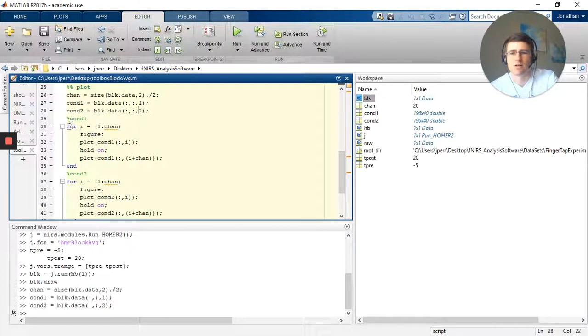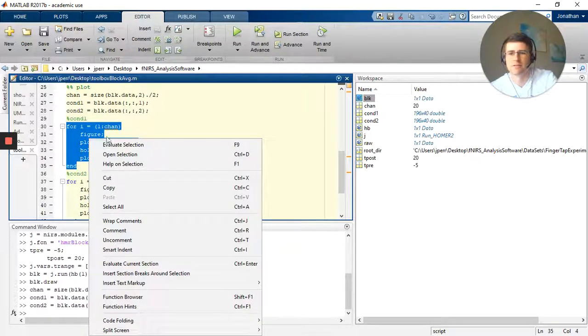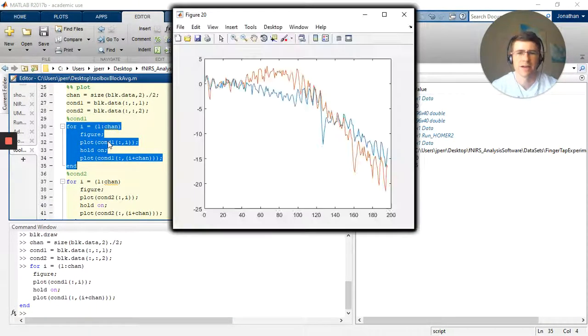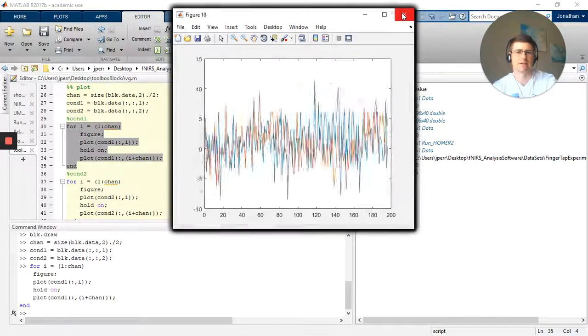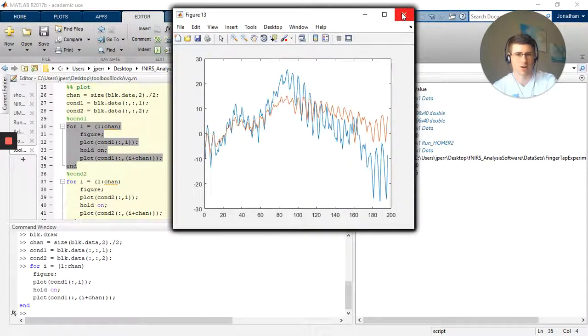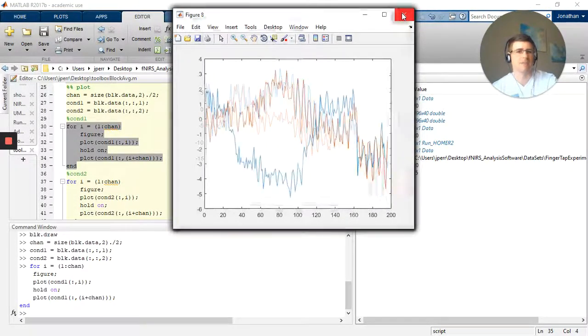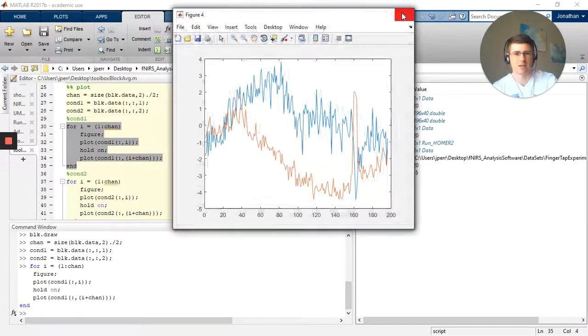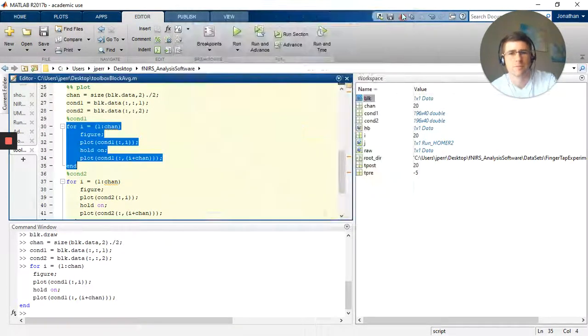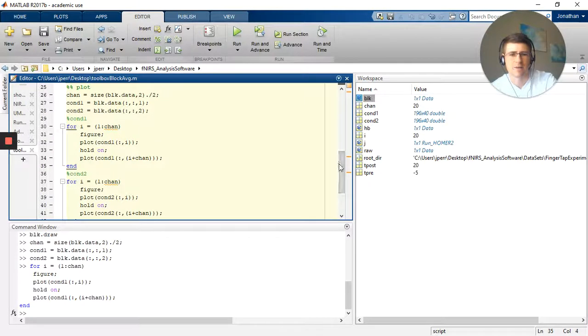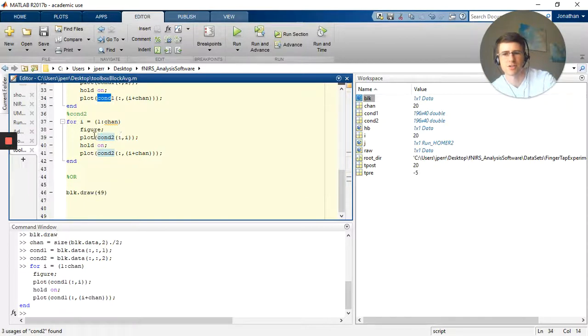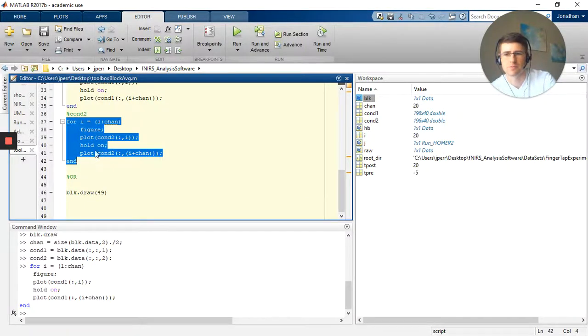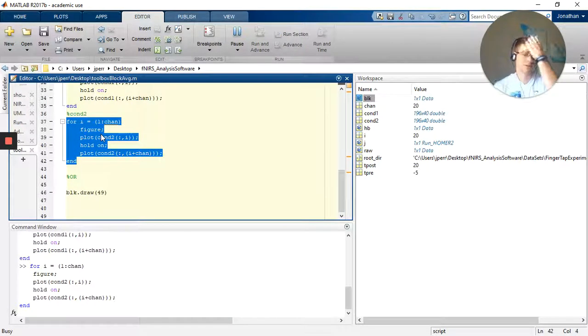So now I want to print out all of the first condition. So I run a for loop through all the channels, and I plot the conditions. Well look at that, there they are. Lovely. They don't really look all that great, but I have my blocks, everything is well and good. So next I want to plot the second condition. So now I just change condition 1, which was up here as condition 1, to condition 2, and I do the same for loop and I plot it. So you can do it this way, it's pretty straightforward.